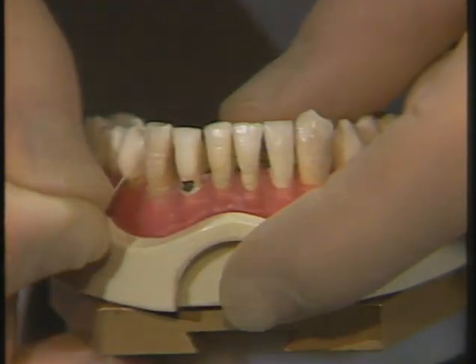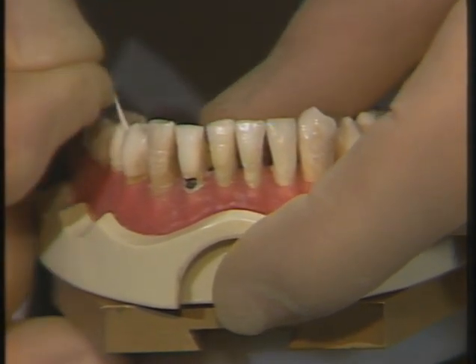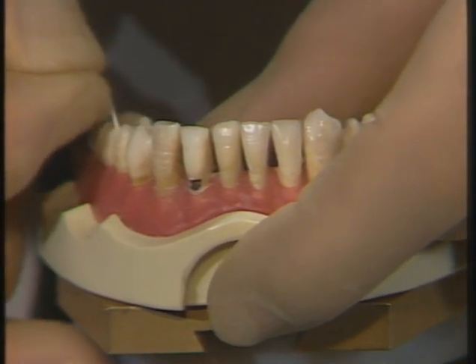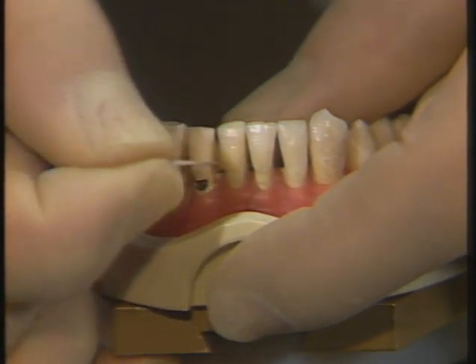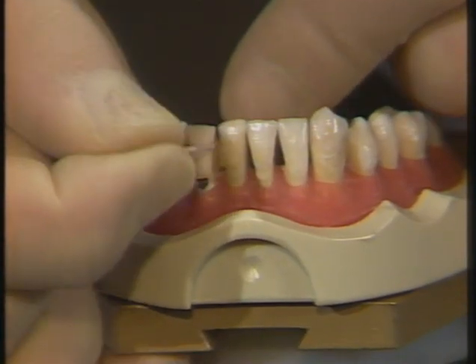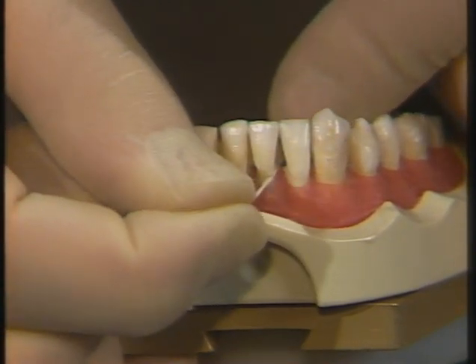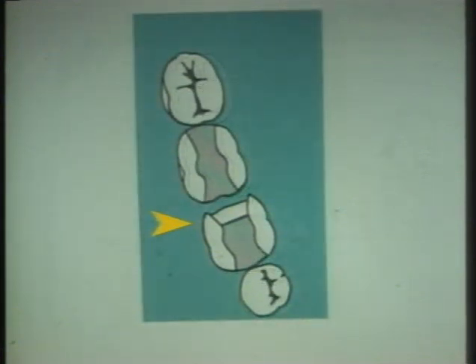Before finalizing the precise teeth to be isolated, it is desirable to pass a piece of floss or tape between the contacts so as to identify any that are particularly slack and any that are particularly difficult. Where the contacts are slack, lubricant will not be used, and where they are difficult, it may be possible to avoid them. Sometimes it will be appropriate to remove part of a restoration in order to facilitate the rubber dam application.